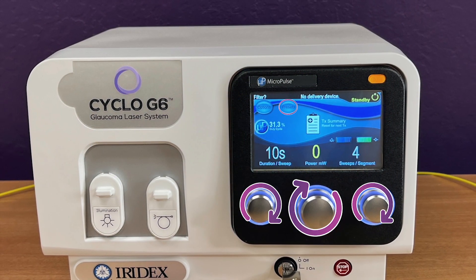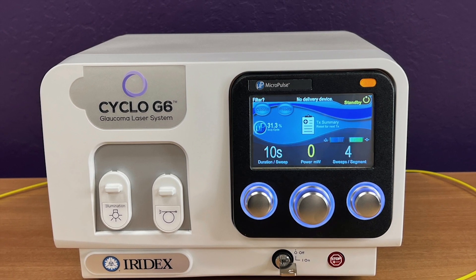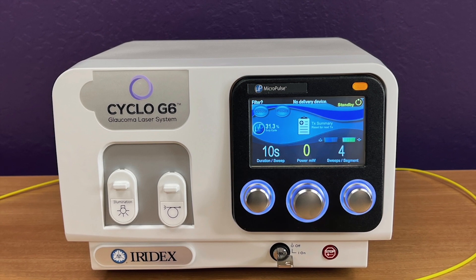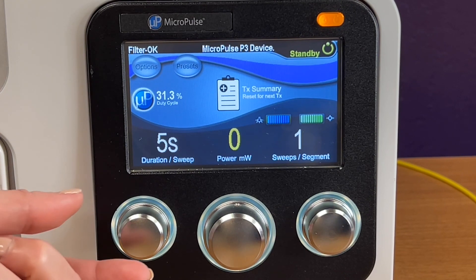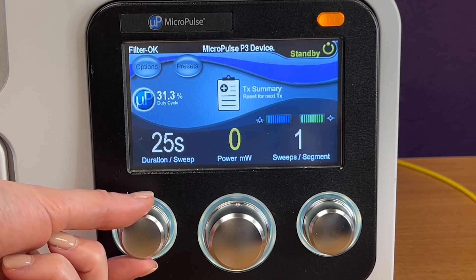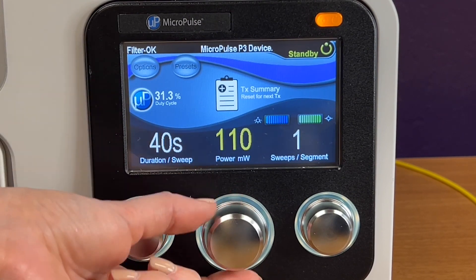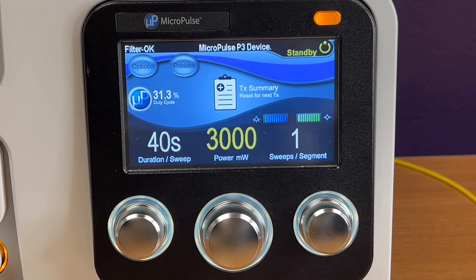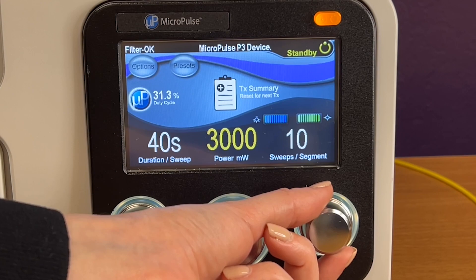This is the standby screen. Program your treatment settings either manually by using the control knobs, or by choosing one of ten presets after the presets have been programmed to your desired settings. Treatment settings include the duration per sweep, with setting options ranging from 5 to 40 seconds in 5-second increments. Power settings range from 0 to 3,000 milliwatts in 10 milliwatt increments, and the sweeps per segment field ranges from 1 to 10 in 1-sweep increments.